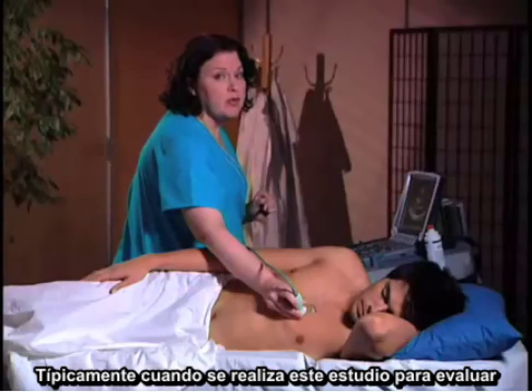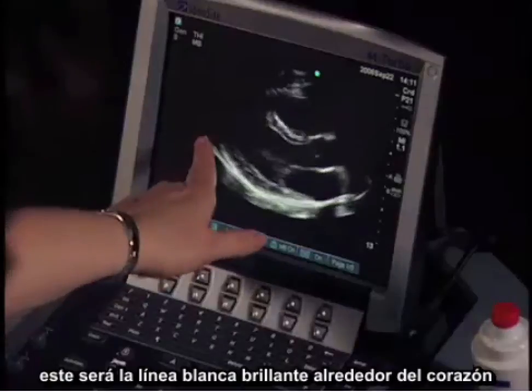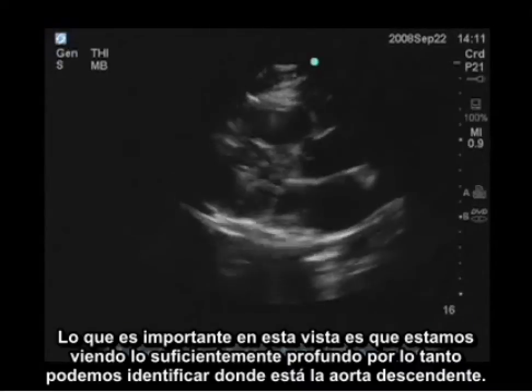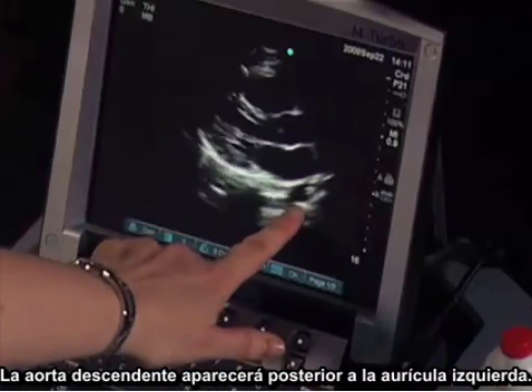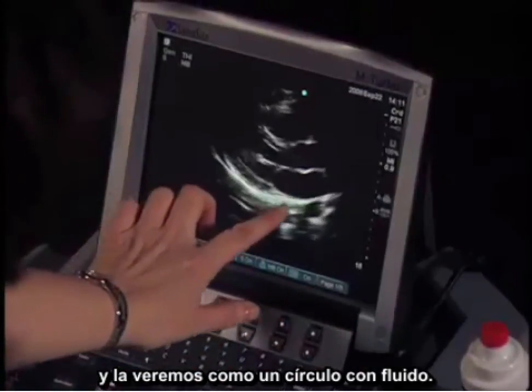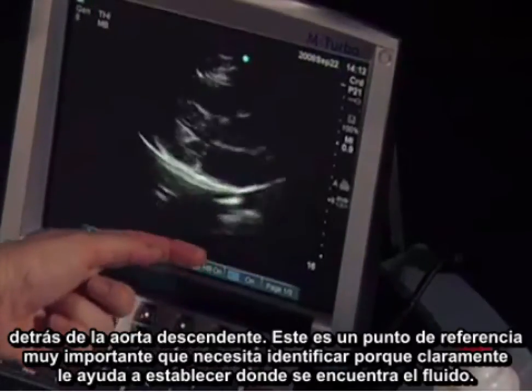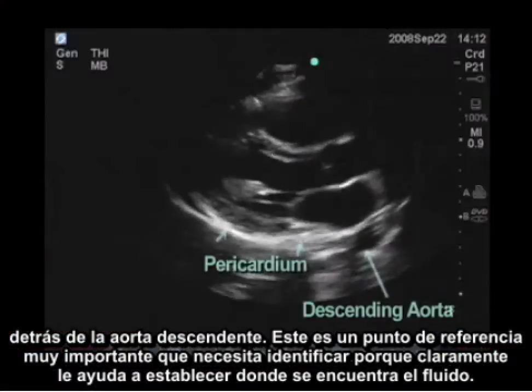Typically we're doing this examination to evaluate for pericardial effusion, so we want to identify the pericardium — this bright white line around the heart. It's important in this view that you have it deep enough so that you can identify where the descending aorta is. The descending aorta appears posterior to the left atrium and we see it as a round circle. If fluid is in the pericardium, it's going to be above the descending aorta. If it's a pleural effusion, it's going to be behind the descending aorta. This is a very important landmark to clearly establish where the fluid is present.